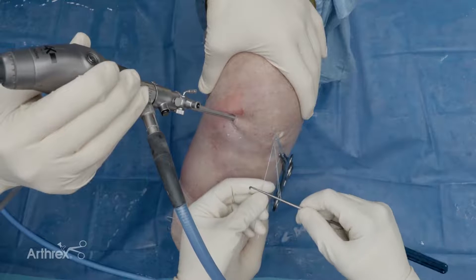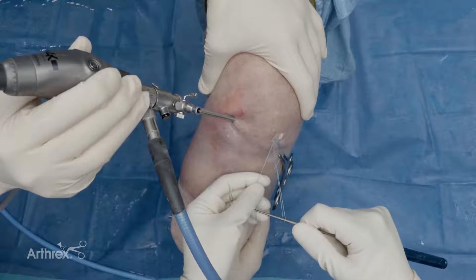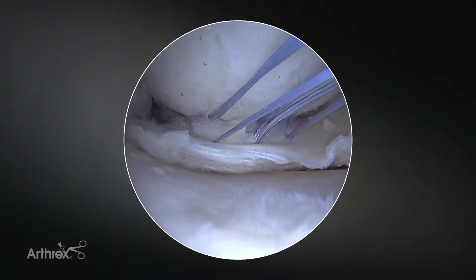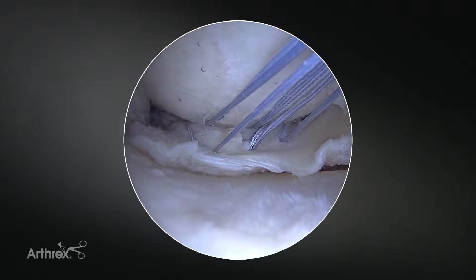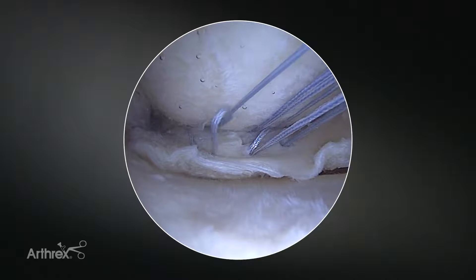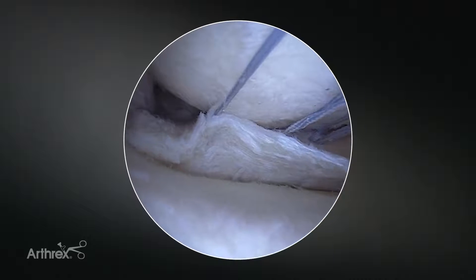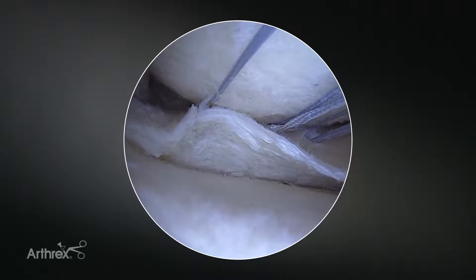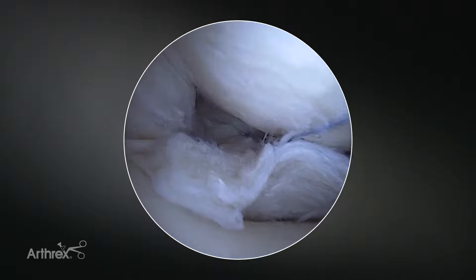We're going to set the first vertical mattress stitch. We have the loop out here and we're going to tension this down. We can really dial in the tension that we like to see. Then we'll take the probe out and pull on the simple strand to tension down the second. What we see happening now that I've tensioned it down is the tibial side starts to evert itself, which does make subsequent placement of femoral sutures a little bit more difficult.